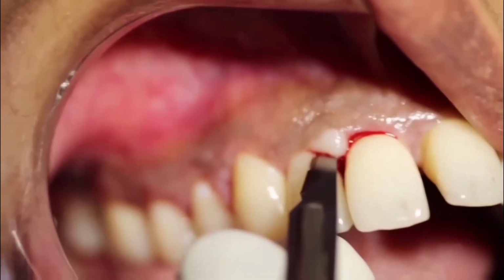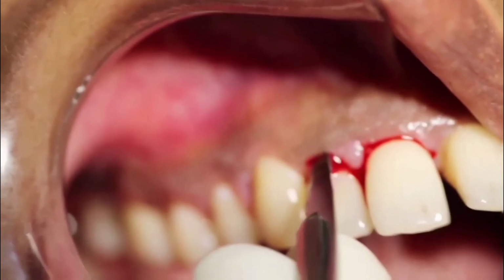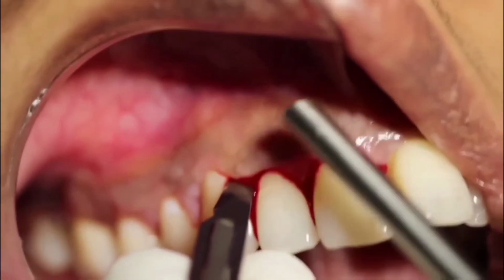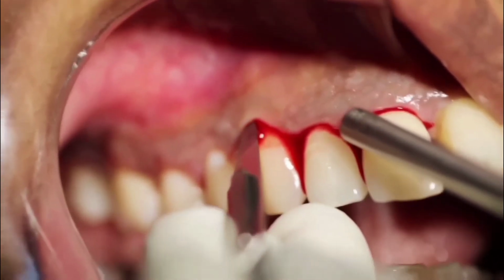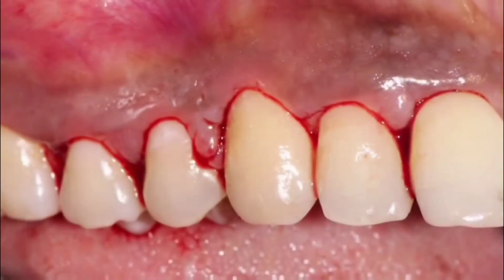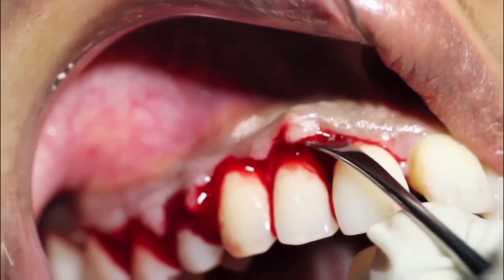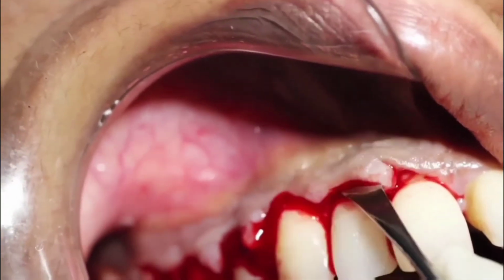Now we have periodontal flap surgery. An incision was given using a number 15 blade. The blade was directed from the gingival sulcus towards the alveolar bone crest. Next, a full thickness mucoperiosteal flap was reflected by using a periosteal elevator. The flap was reflected by taking support from the underlying bone.